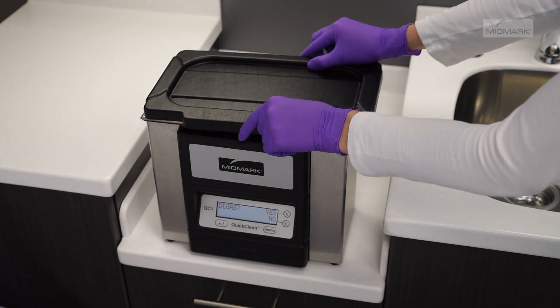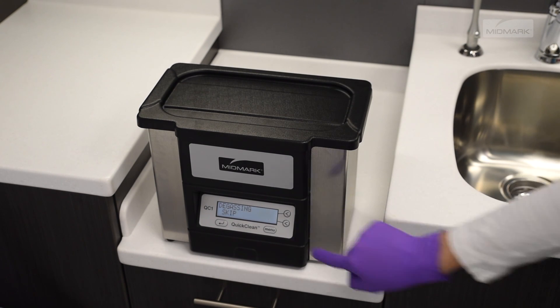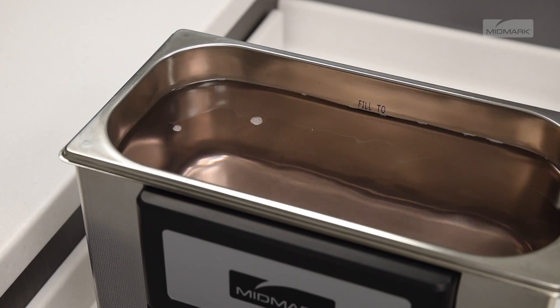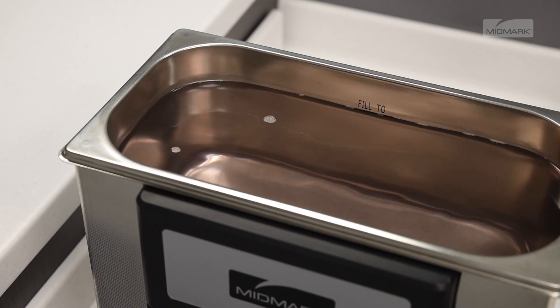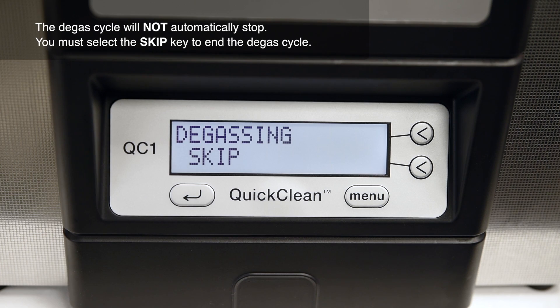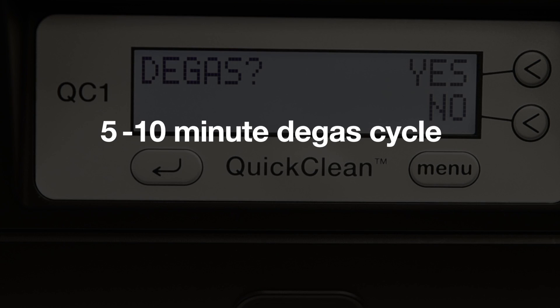Place the lid on the ultrasonic and select the yes key to start the de-gas cycle. The amount of time needed to de-gas the liquid will vary depending on the amount of gas present and the quantity of water in the tank. During the de-gas cycle, you will see bubbles of gas forming and slowly rising to the surface inside the ultrasonic tank. When you no longer see bubbles rising to the surface, you can end the de-gas cycle by pressing the skip key. A 5 to 10 minute de-gas cycle should adequately de-gas your unit.